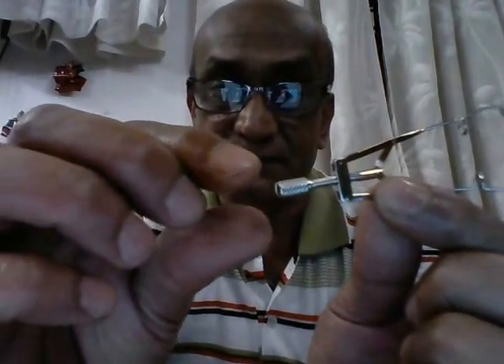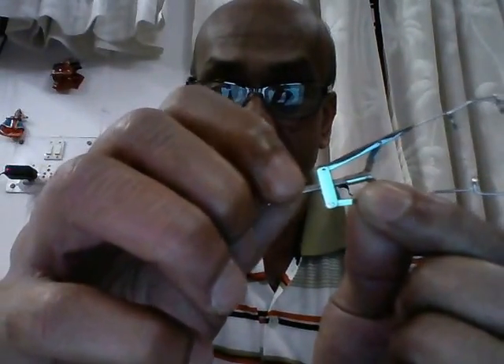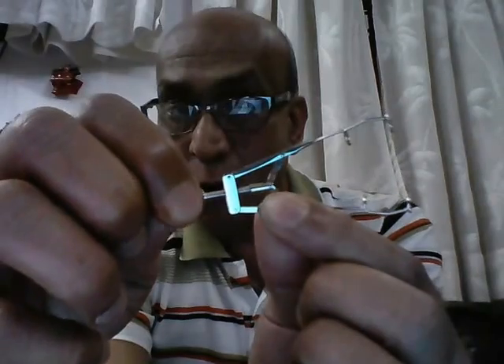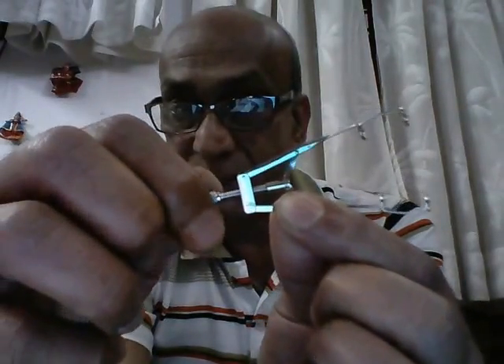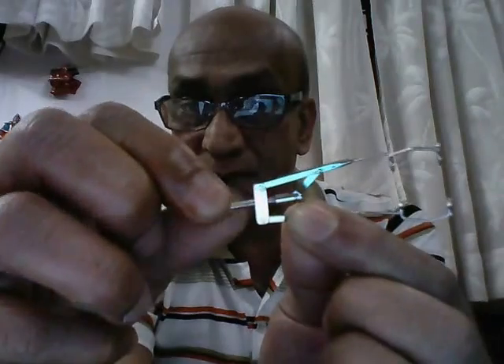Now, there is another interesting aspect to this eye speculum. Normally, whenever we have any screw handle, it is a universal rule that when you turn the screw in a clockwise direction, you close the instrument. But in this case, turning the screw in the clockwise direction opens up the eye speculum, and turning the screw in the anti-clockwise direction closes the eye speculum.